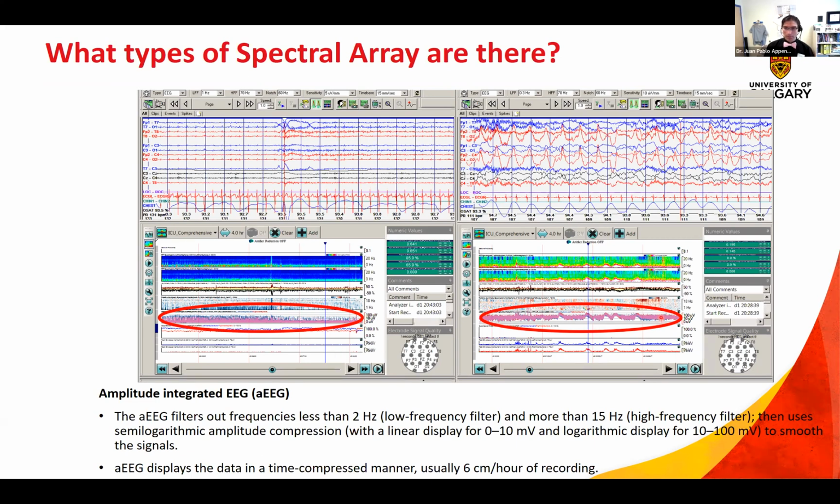channels. Here, as you can see, the Amplitude Integrated EEG in this particular arrangement is not blind to the seizure, even though it's occipital. The reason being that it's a combination between all the electrodes in the left. Therefore, we have more information to determine whether, on the left and the right, sorry, to determine whether there was a seizure or not.